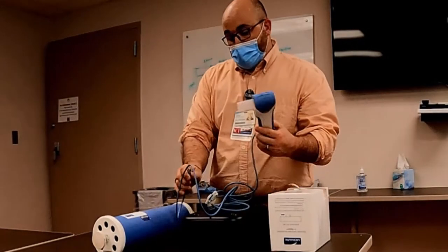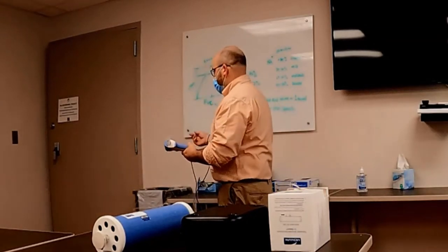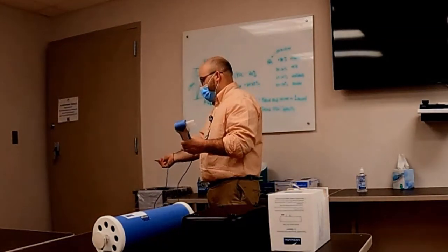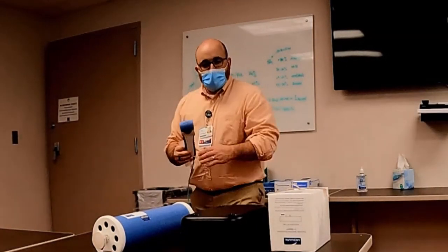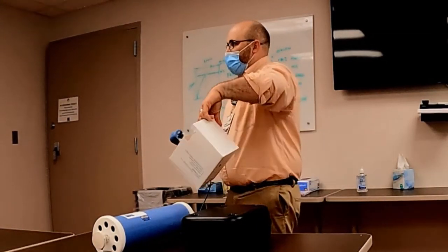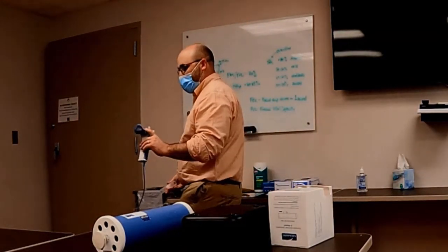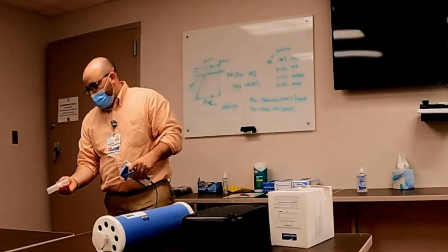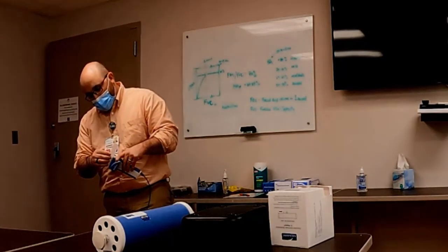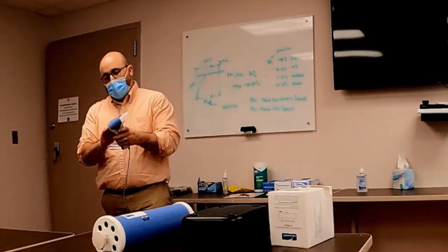All right, so spirometer, this is the one that you guys have. It is kind of the baseline. You have a program in the computer, you plug this in. This piece right here is disposable. They come sealed, so it's a one-time use thing. Very easy, they make these things super simple so you can't mess them up. There's three holes there. There's three nubs, two are next to each other. You look at the holes next to each other, these go in. That goes over, clips.